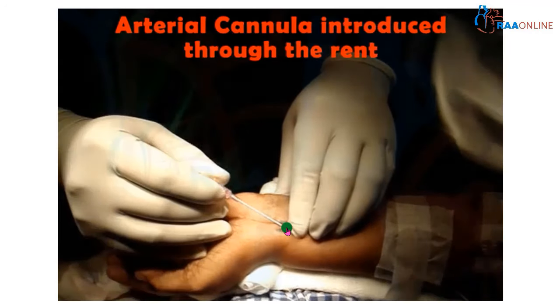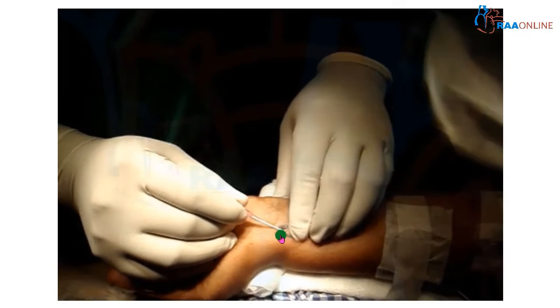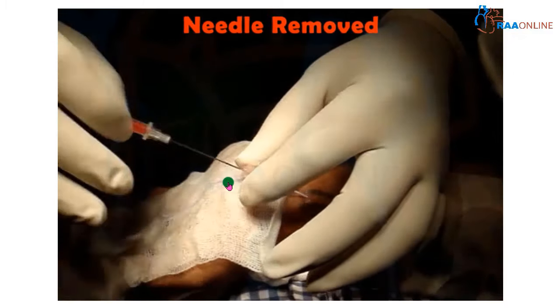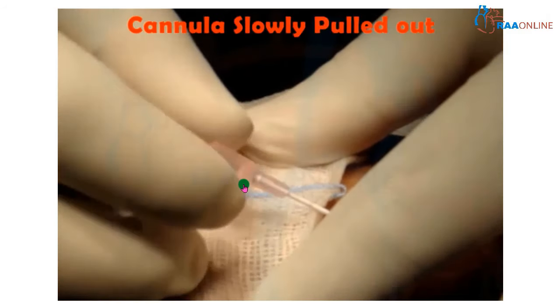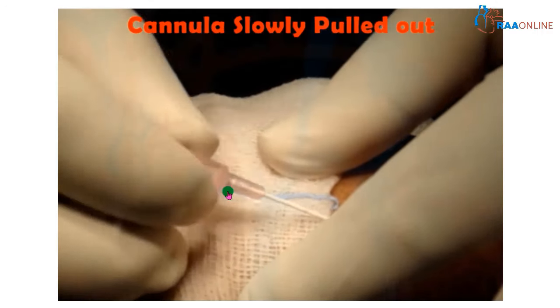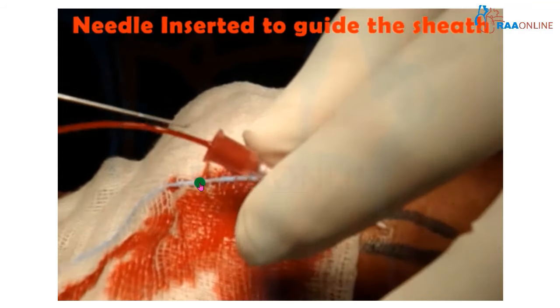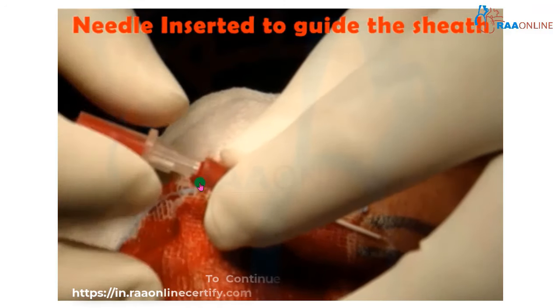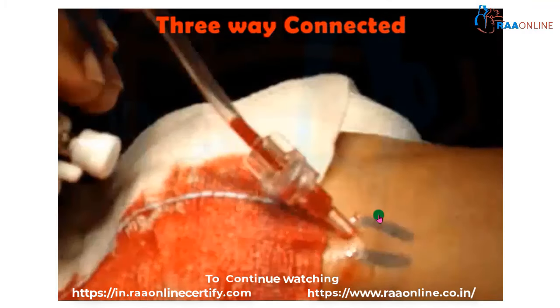Now you can see the over-the-needle catheter is passed. As the catheter and needle are passed inside the lumen, you can see the blood spurt. I have advanced it further and now I am slowly coming out — I can see the spurt here. Once you see the spurt, you can use a guide wire or the needle to guide the catheter inside the vessel lumen. Now the catheter is inside the vessel lumen.